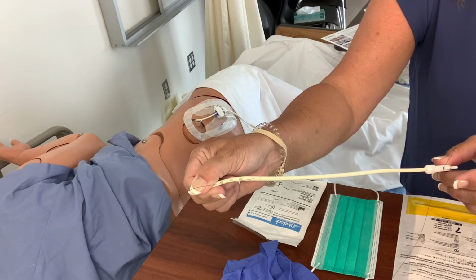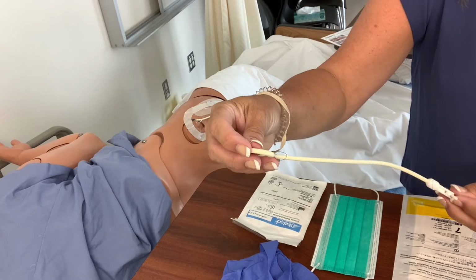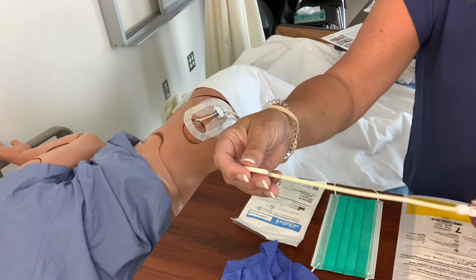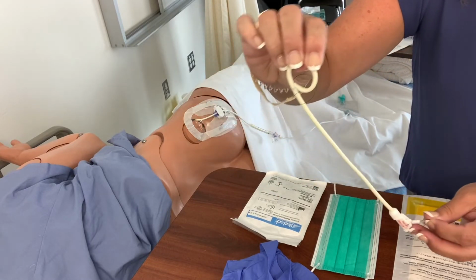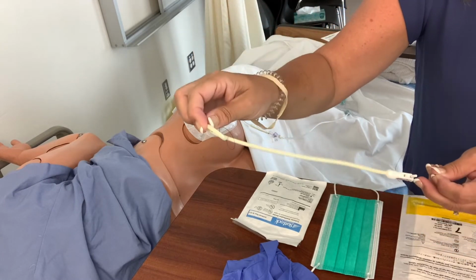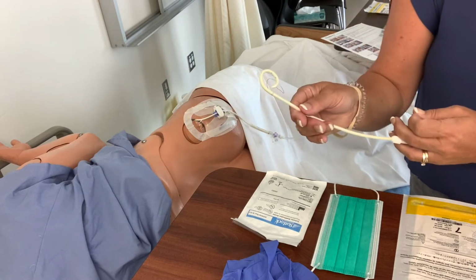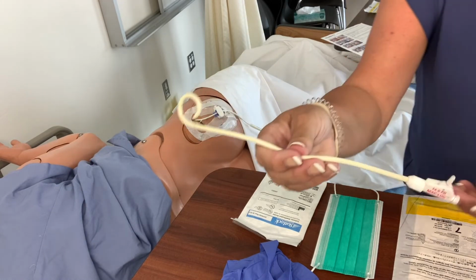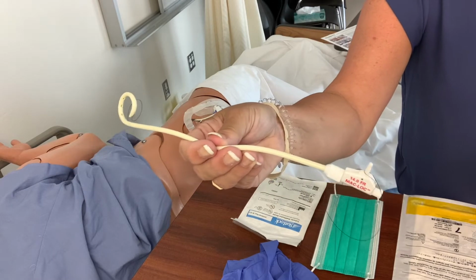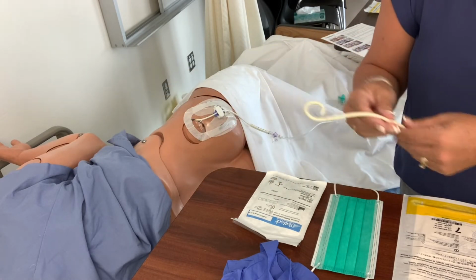When the hard device that keeps this straight gets pulled out, it coils backwards, and there's a little cord here that I can use to pull it in tighter. It coils sort of like a pig's tail. That's basically what holds it in. This is the pigtail, and I just wanted you to see what it looks like. It's typically not sutured in, so you need to be careful when you're dealing with it.